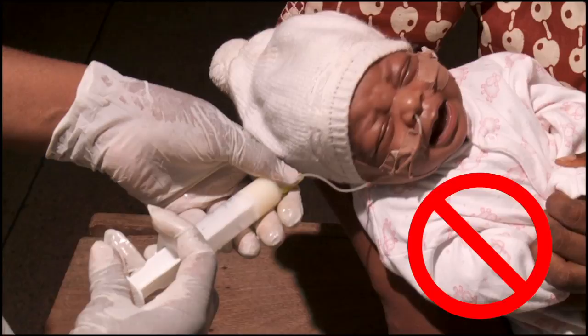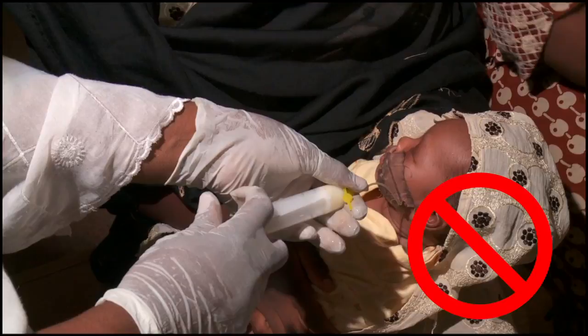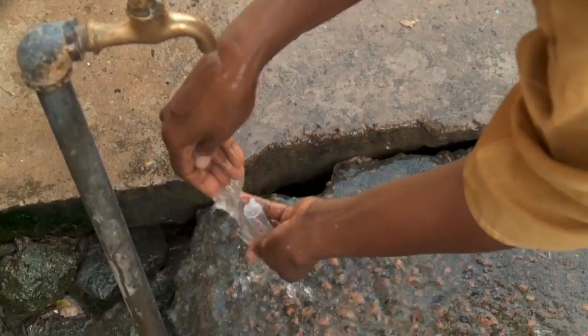Wash the feeding syringe and cup with soap and water for the next use. Encourage the mother to put the baby to her breast before each feed — this helps babies more quickly develop their feeding skills and improves the mother's milk production.